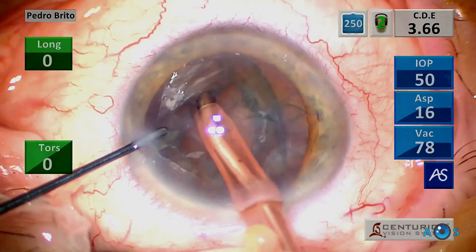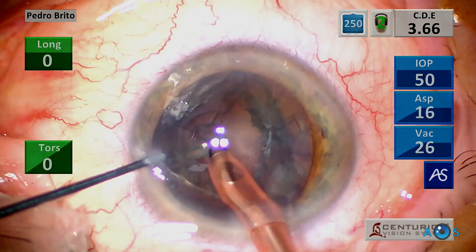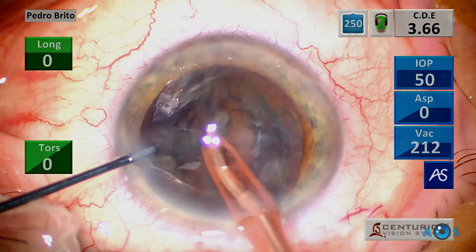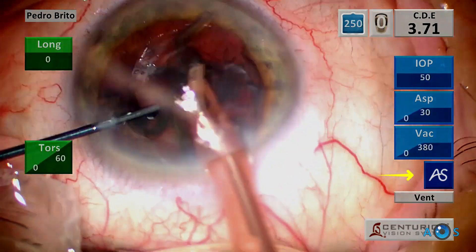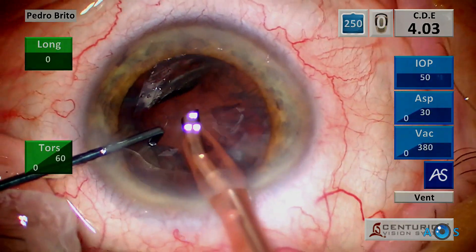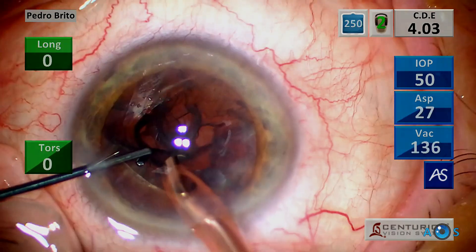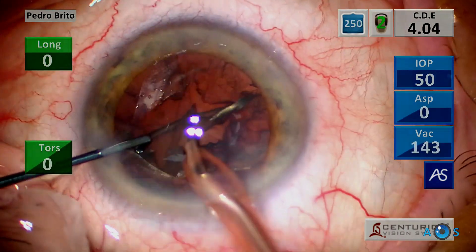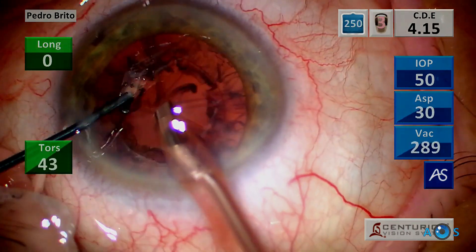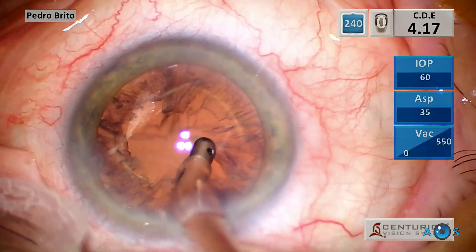Now on to the epinucleus removal step. Notice that a working IOP of 50 mmHg is now perfectly stable, as vacuum pressure and aspiration flow rate are switched to full linear control. The chamber stability is further improved by using the active sentry FACO handpiece, which continuously monitors the IOP, adjusting to compensate for fluid leakage, vacuum surge, and other FACO dynamic variables.